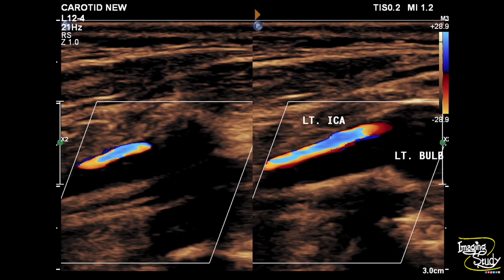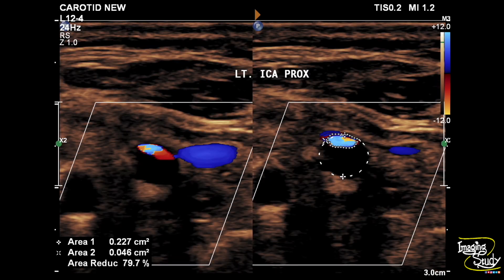Here is the picture — you can see the lumen shows a narrow turbulent flow. This sonoleucent area is completely filled with a type 1 plaque. Type 1 plaques are sonoleucent and can only be seen on color Doppler as signal void areas. From our measurement, you can see almost 80% luminal narrowing at this point.